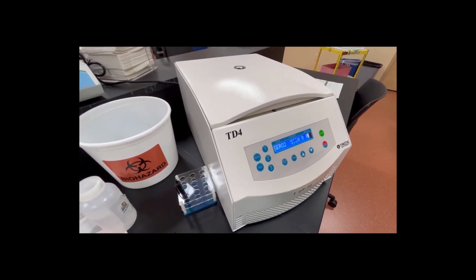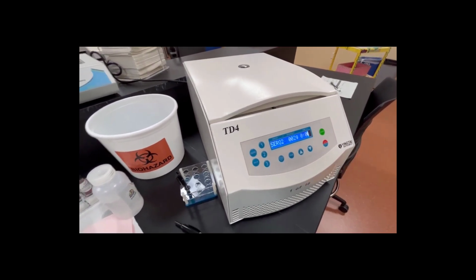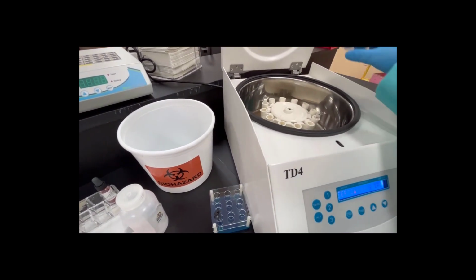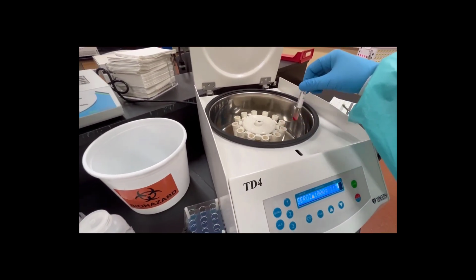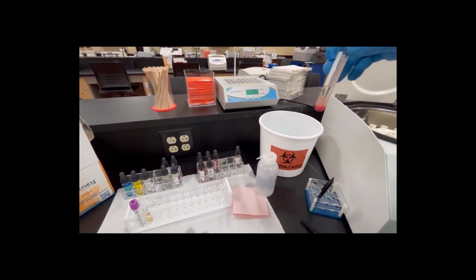Okay, speed is coming down. It hits 0. The lid's going to automatically pop up here in a minute. It's going to start making a lot of noise, telling us it's done. So I have my balance tube that I'm going to put back in the rack, and I've got my patient sample, and you can see it's got the cells on the bottom. It's got a little bit of cloudy stuff.